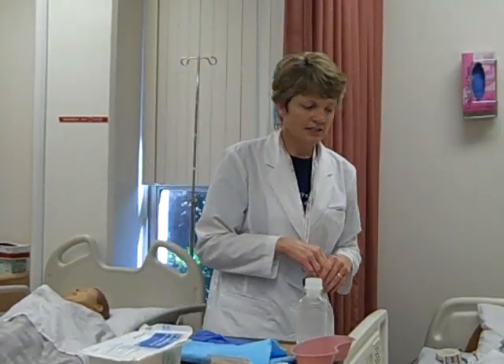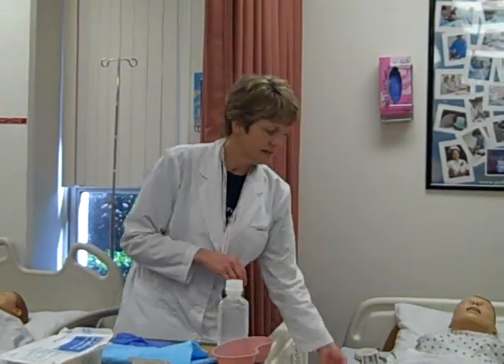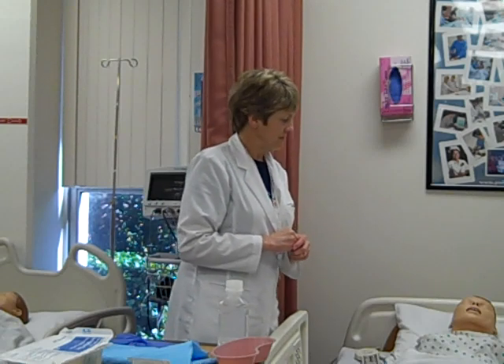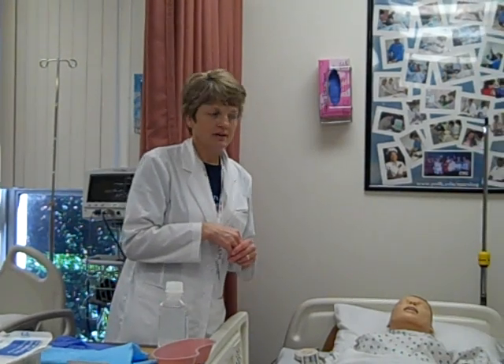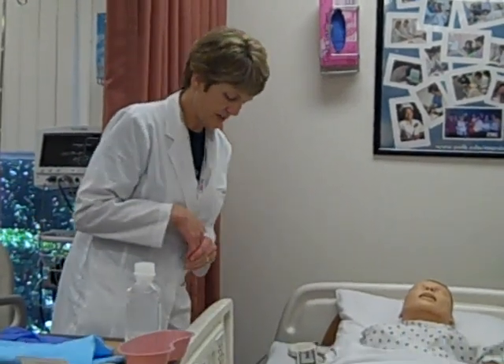I've done my checks, checked my doctor's order, checked my patient's allergies, explained the procedure, and I'm going to go into the room and make two forms of identification always. I'm going to explain to the patient that I'm going to be irrigating his right eye today. He was hospitalized after some kind of trauma and they thought he had something in his eye, so the doctor wants it irrigated.